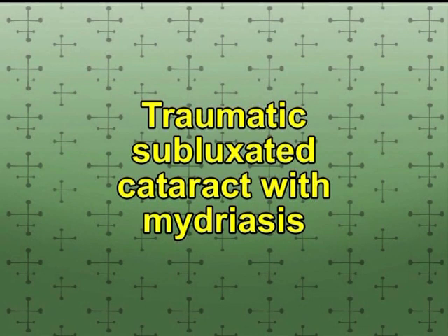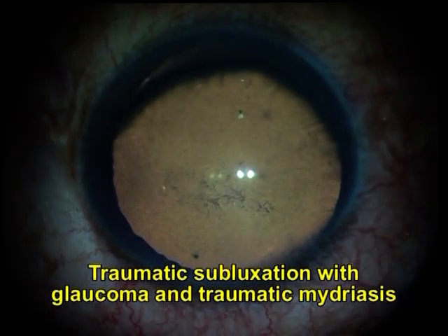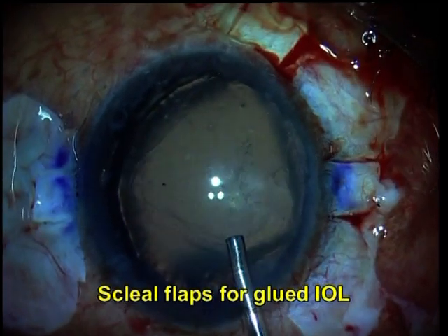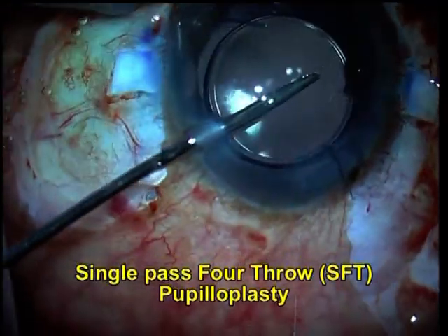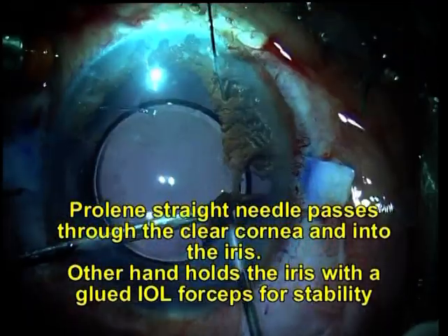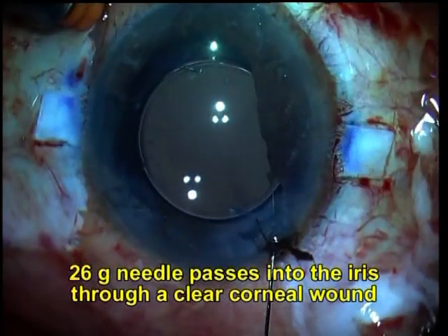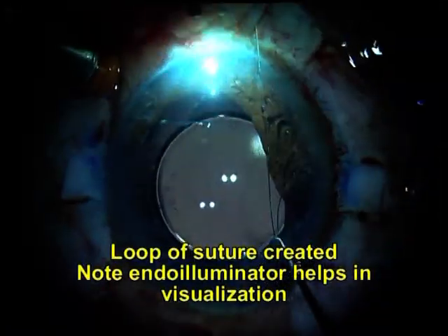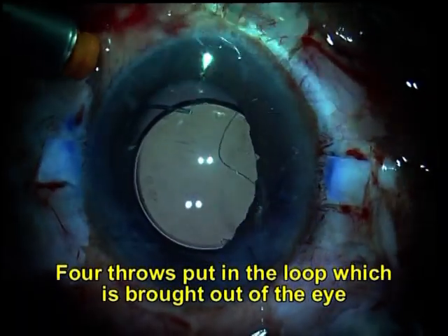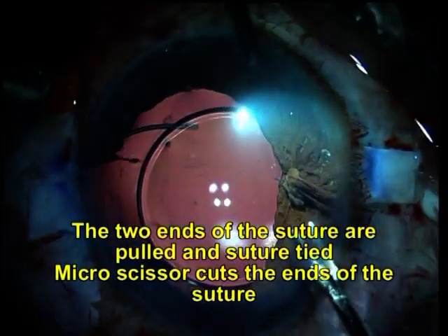Now let's take a traumatic subluxated cataract which has a traumatic mydriasis. In this case, we did a glued IOL with two scleral flaps. And once the glued IOL was done, we started working on the single pass 4-throw pupilloplasty. You can see the prolene needle passing through the cornea, and from the other end the 26-gauge needle going through the entry wound in the AC. The loop has been made, the throws put — 4 throws — and the two ends pulled to get the pupilloplasty done. The micro scissor subsequently cuts the suture.